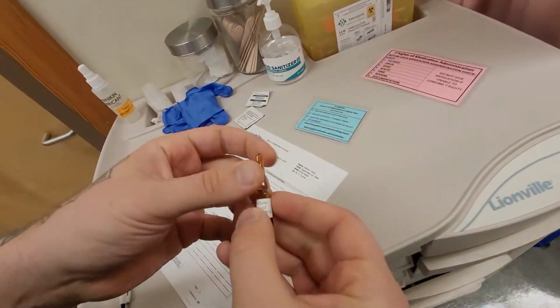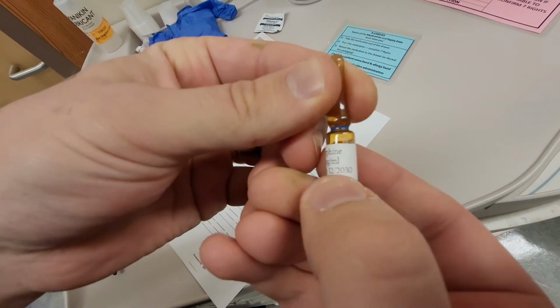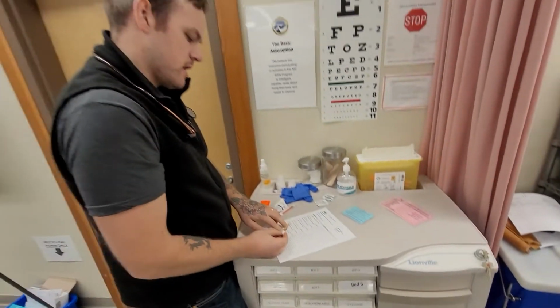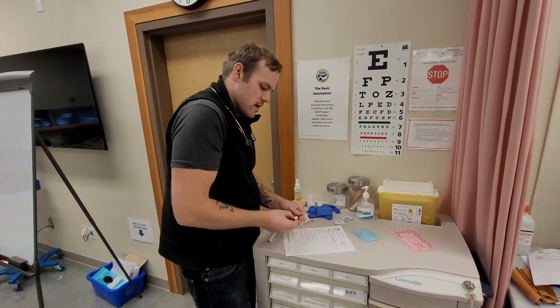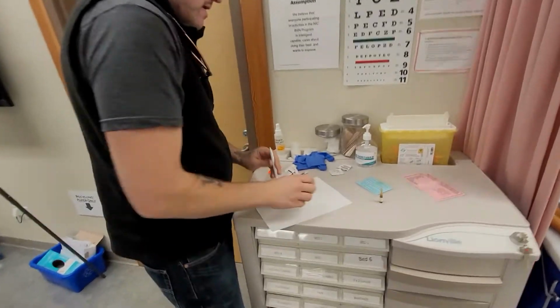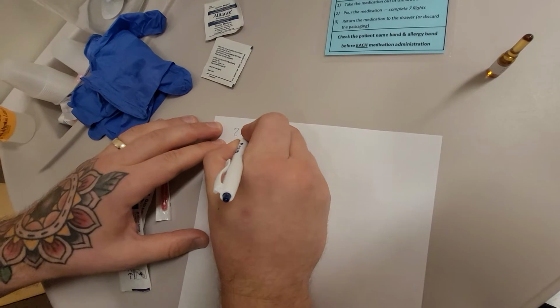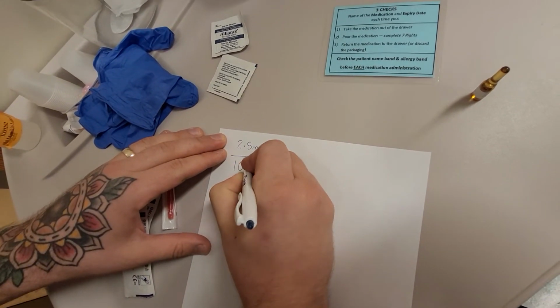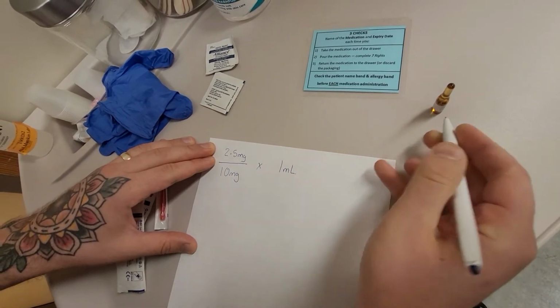So this is morphine, expiry 12/20/30. And we're going to have to do some medication math, because 2.5 milligrams is ordered and it comes in 10 milligrams per milliliter. So we're going to do that math right now. We're going to have our desired dose, 2.5 milligrams, over our have on hand, 10 milligrams, times 1 milliliter, which is what it's supplied in.